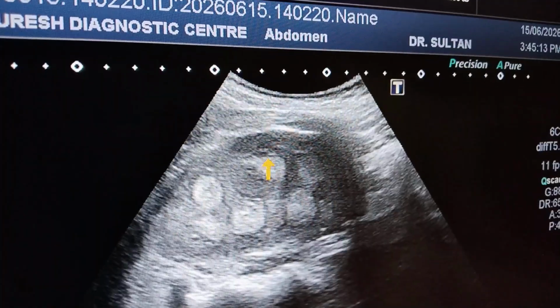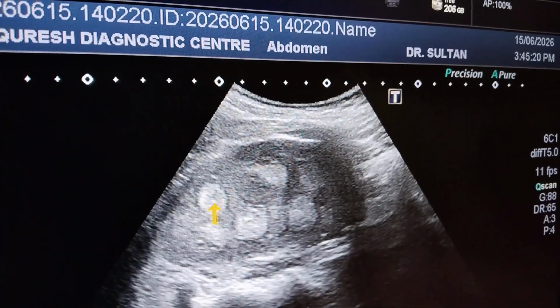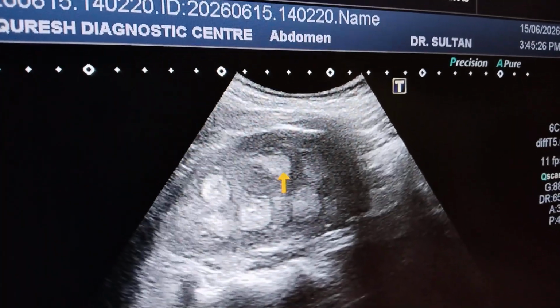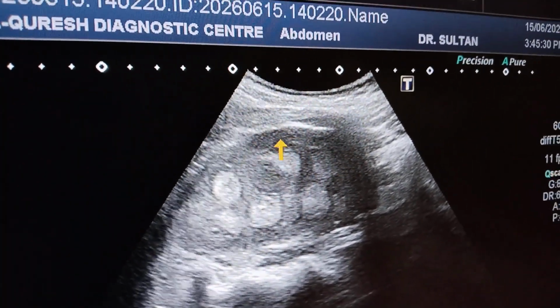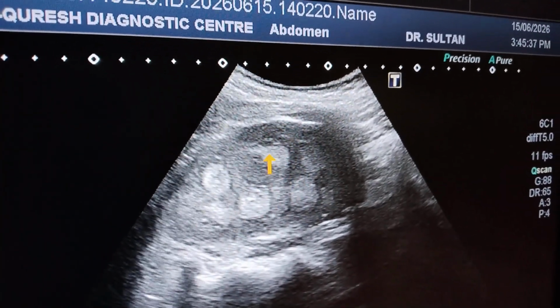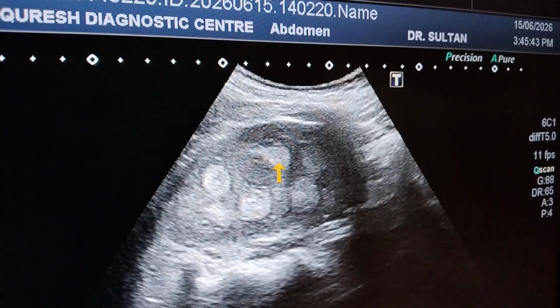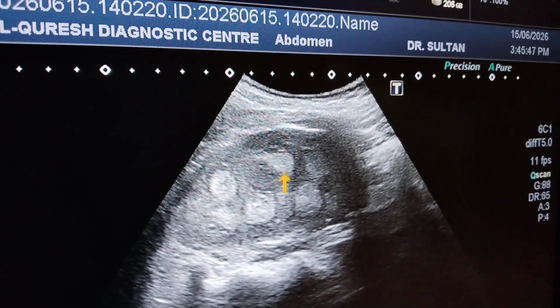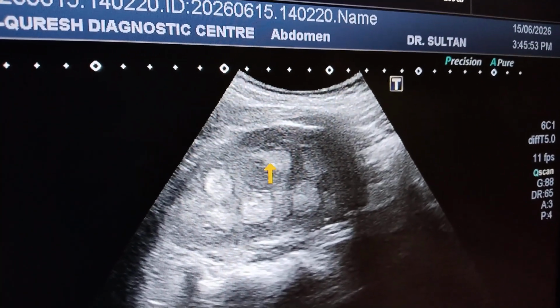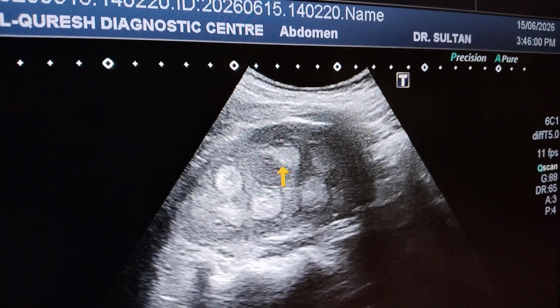अगर कैल्शियम सीरम लेवल पे ज़्यादा हो, कैल्सियूरिया, हाइपरकैल्सीमिया हो, या फिर ये जो कलेक्टिंग सिस्टम है वो हाईली एसिडिक हो जाए, काम करना छोड़ दे, देन salt deposits here in the collecting ducts, so these then pyramid appear hyperechoic क्योंकि यहाँ पे कैल्शियम डिपॉजिट हो रहे होते हैं। When the condition further worsens, then the crystal formation occurs and then the calcification occurs and these again become highly calcified, and then further it may give the shadowing also.